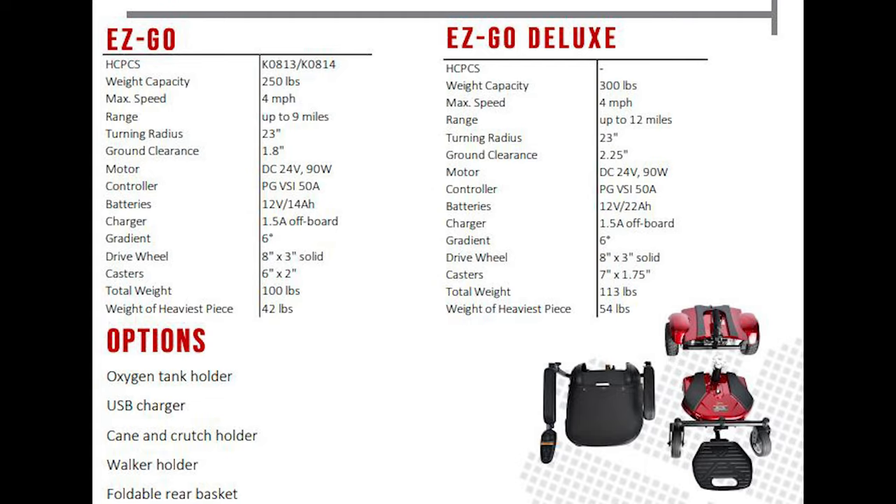It weighs only 113 pounds when fully assembled, but you can take it apart and the heaviest piece only weighs 54 pounds. We're leaving the spec sheet on screen so you can see the difference between the deluxe and standard versions. The deluxe version holds 50 more pounds with a maximum weight capacity of 300 pounds, a range of 12 miles, and a top speed of 4 miles per hour. Feel free to go back to this spec sheet at any time as we get started with the unboxing and assembly process.